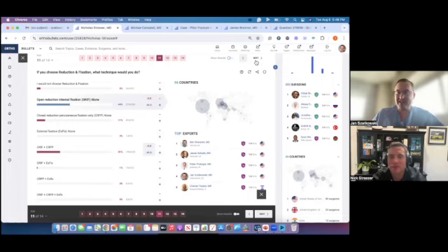Yeah, the same type of answers here. If you're going to choose ORIF alone, what fixation type would you use? Plates and screws. I kind of wish they would have put staples in there. I didn't think about that when we were putting this question together. Maybe they did, and I just don't see it. But there's a staple, yeah.